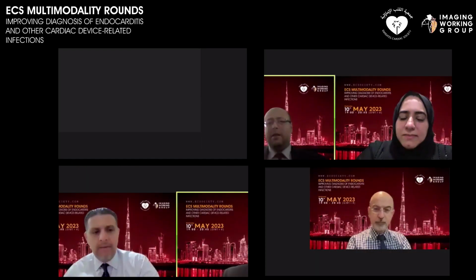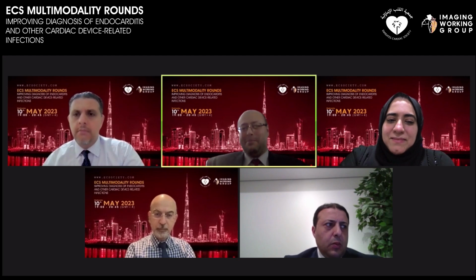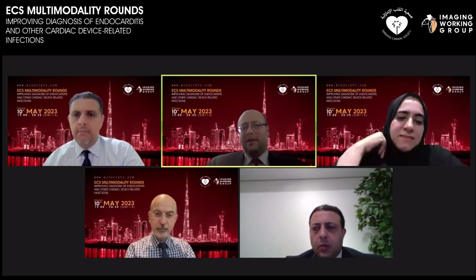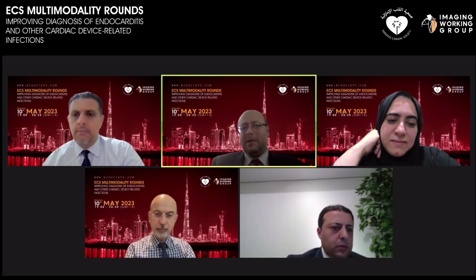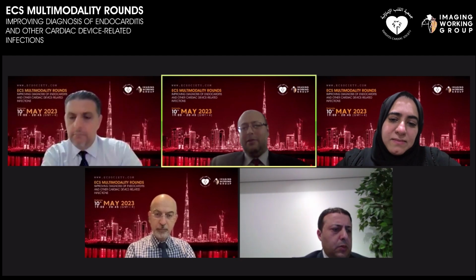Yeah, so for viability, you want the myocyte to take FDG. For infection, you want the myocyte not to take FDG. So they are completely opposite preparations. For viability, we want to give the patient insulin, as much as we can, so when we inject FDG, that FDG goes to all these hibernating myocytes.